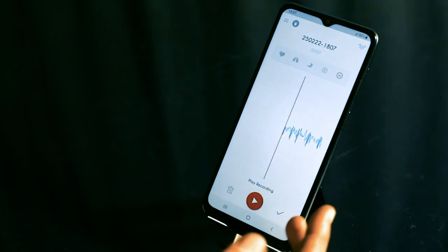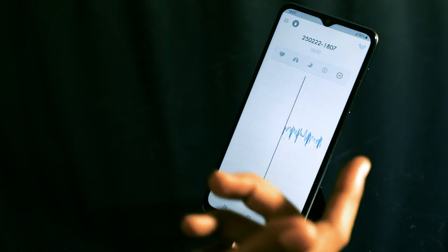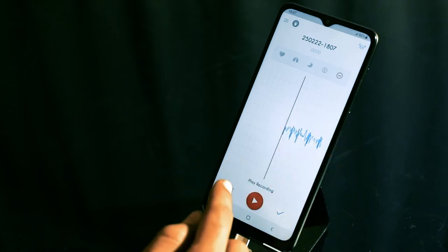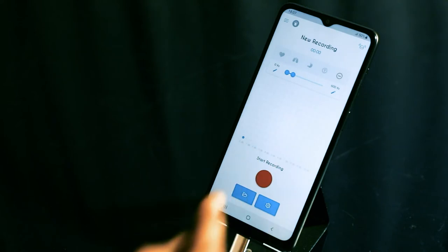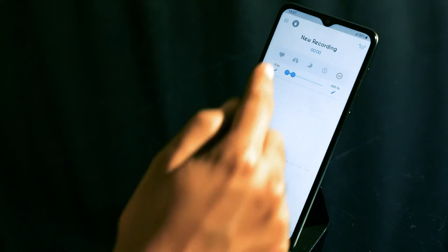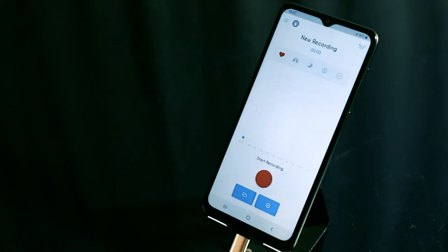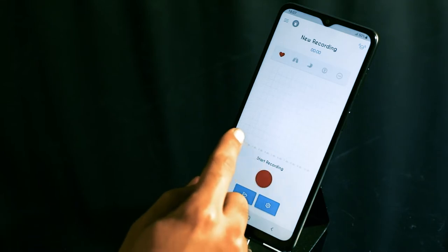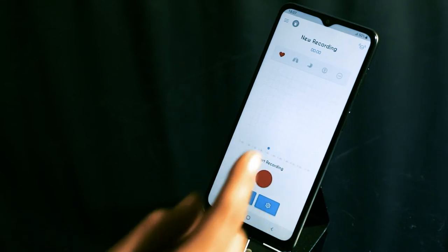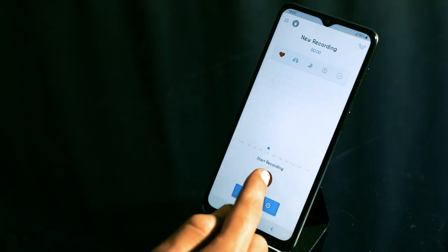If you are unhappy with the sound, as I am because I chose a custom filter, I am just going to delete this. Now I am going to pick the heart filter because that is what I want to auscultate. Increase the volume and start recording.